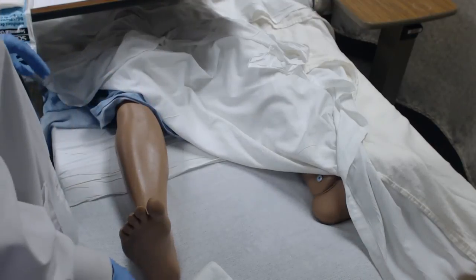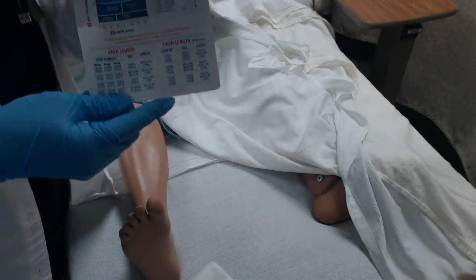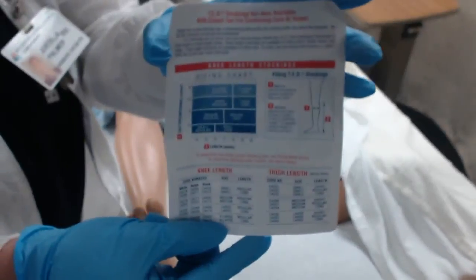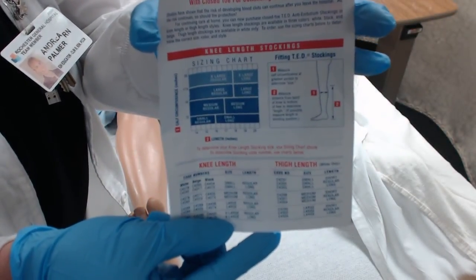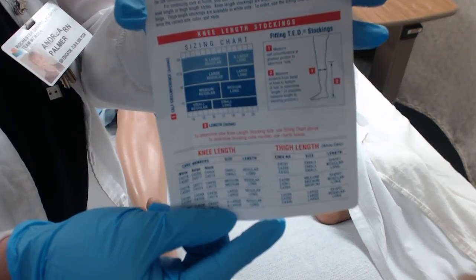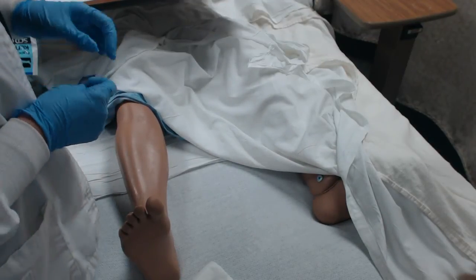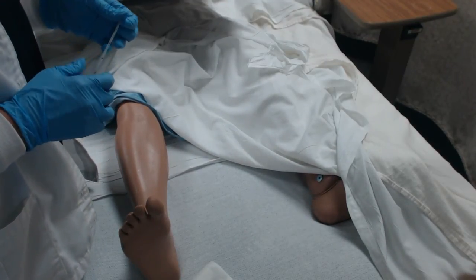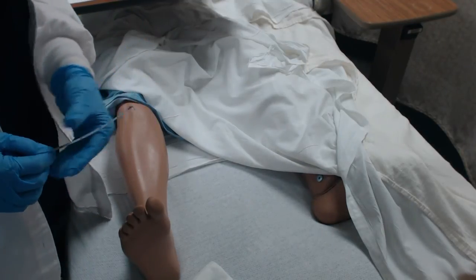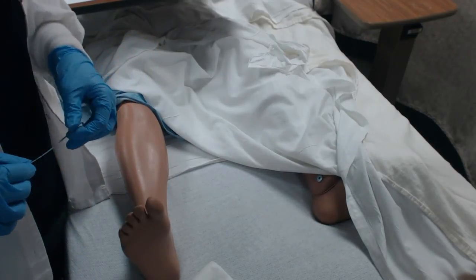So then we're going to actually measure the patient. I'm going to hand this out in lab because you can't see it on the video, but this is a sizing chart. These come with all the TED stockings. In order to size the patient appropriately, we have to make sure that we have a measuring tape. In some packages, they come with a measuring device as well, but here I have a little measuring device, so I'm going to use this.